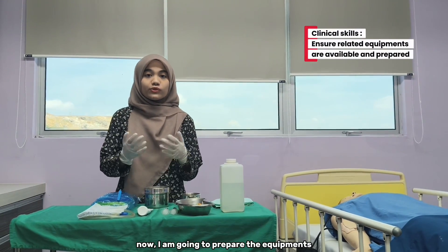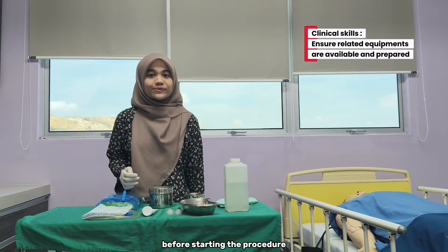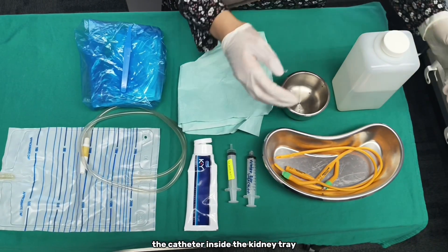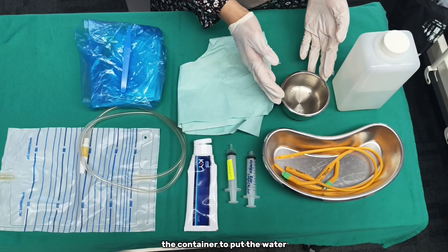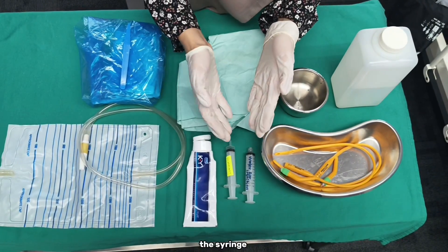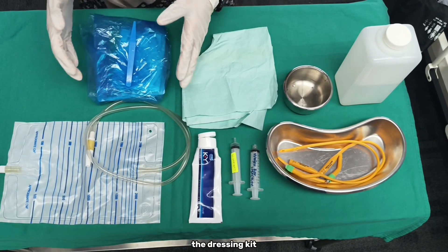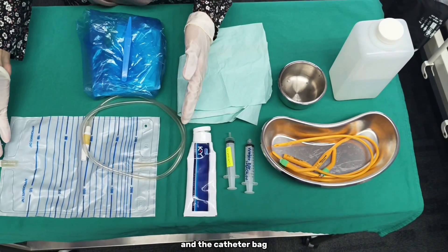I am going to prepare the equipment before starting the procedure. The equipment are the sterile water, the catheter inside the kidney tray, the container to put the water, the syringe, lubricant gel, the sterile drip, the dressing kit, and the catheter bag.